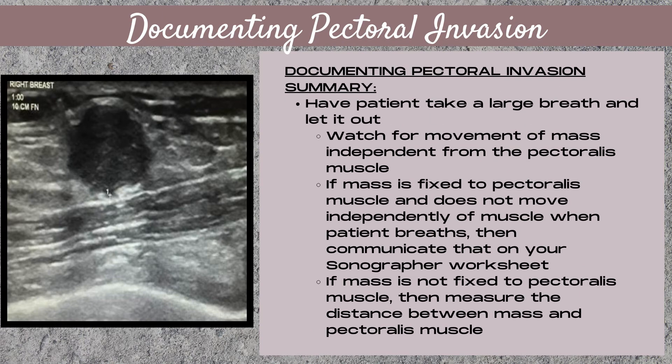Have your patient take a large breath and then let it out. While your patient is doing that, watch for movement of the mass independent from the pectoralis muscle. If the mass is fixed to the pectoralis muscle and does not move independently when the patient breathes, then clearly communicate that on your sonographer worksheet — it's important information for your radiologist to have. If the mass is not fixed to the pectoralis muscle, then measure the distance between the mass and the pectoralis muscle. This communicates to your radiologist that the mass is not fixed to the pectoral fascia, and demonstrates the distance between the mass and the chest wall.